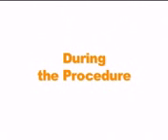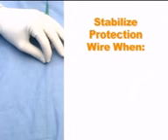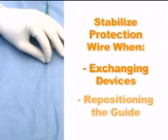During the procedure. To avoid excessive movement of the filter during the procedure, stabilize the protection wire when exchanging devices or when repositioning the guide catheter or guide sheath.